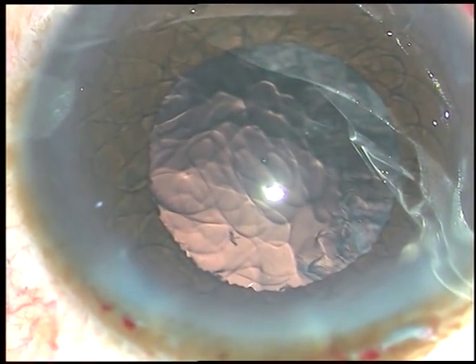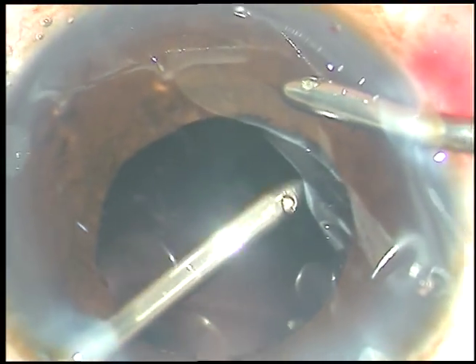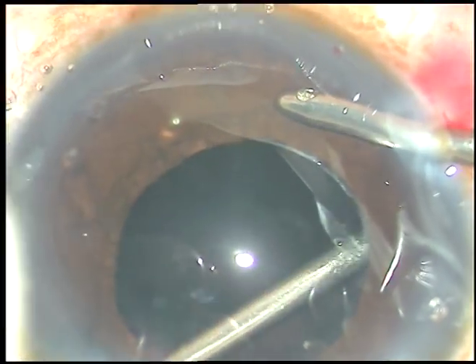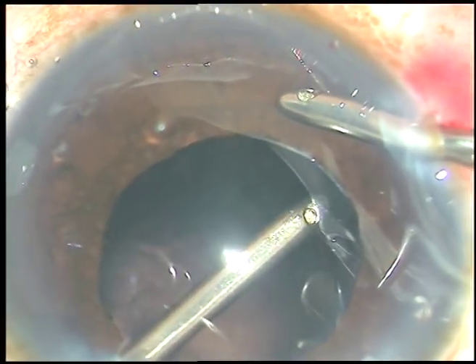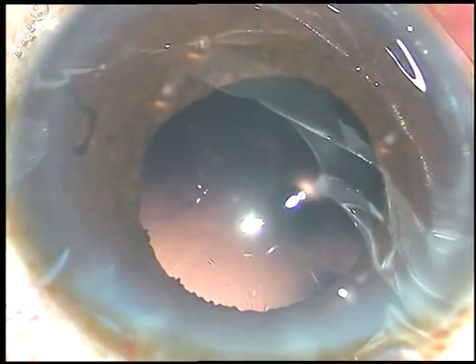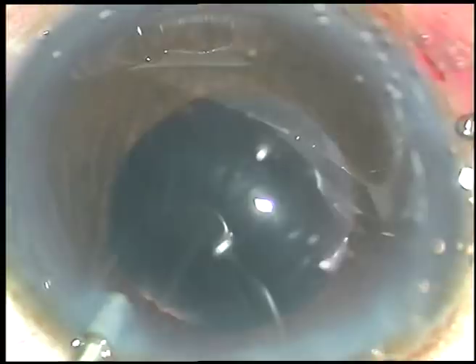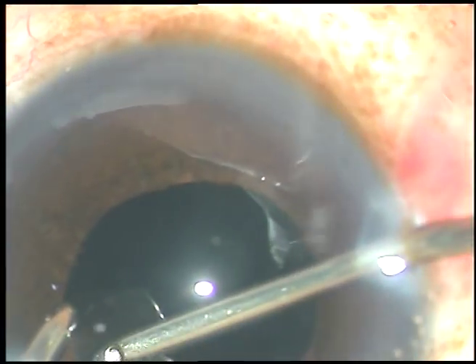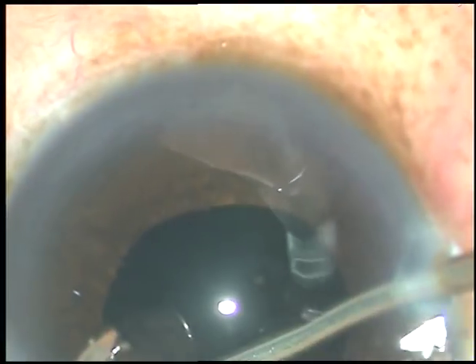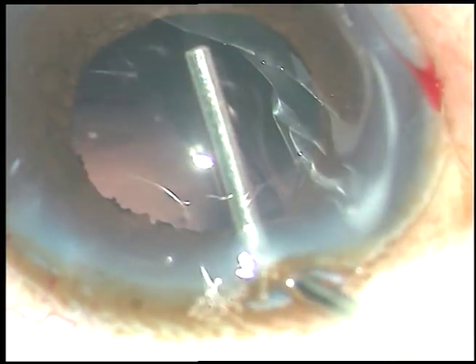Cortical cleanup is done. We must be very careful because we should not catch the posterior capsule and pull it while we clean the cortical matter — try to hold the cortical matter which is behind the iris.